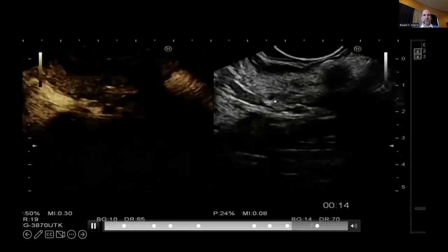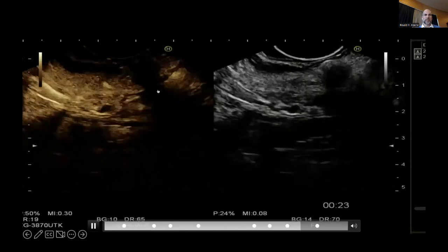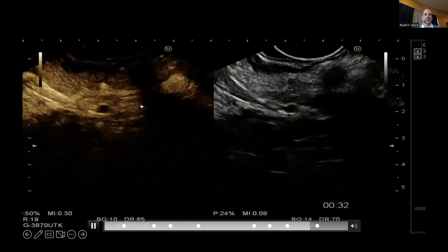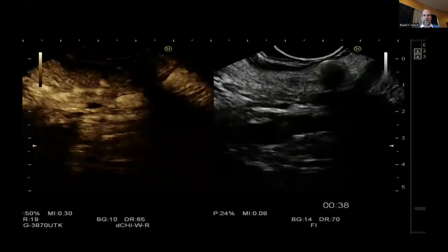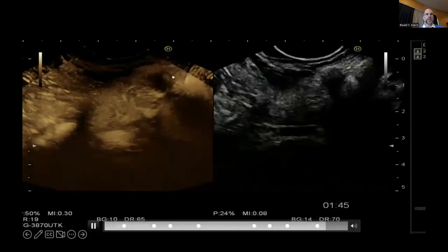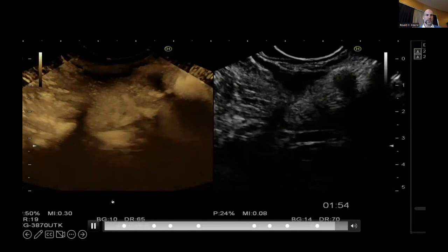And now we use contrast again. We see the contrast here in the vessel, but the ablated area is in this area. It's not that clearly demarcated in these images as in the first. And we also reapply this. Now we have the accumulation mode, and we see that the ablated area is darker, and we still have these artifacts from the movements that I mentioned earlier.